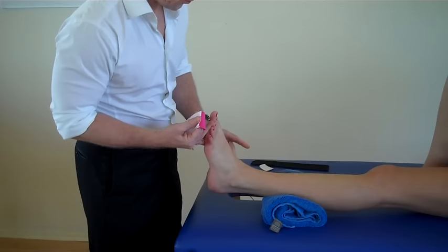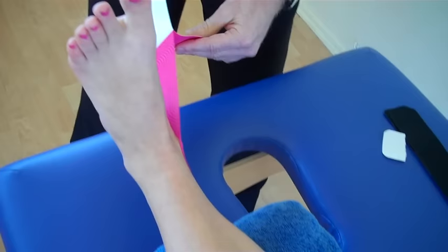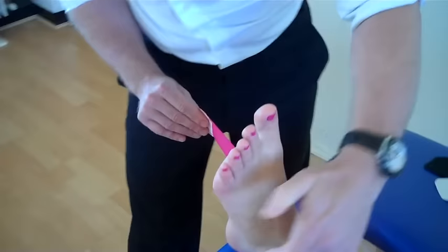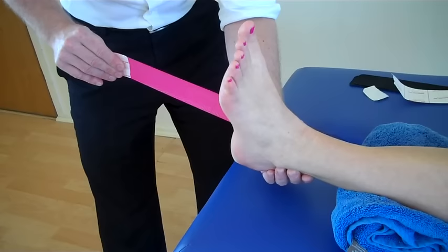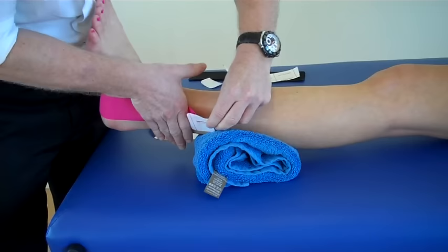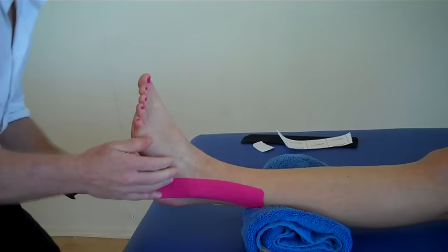Apply with no stretch just above the medial malleolus, then take most of the tape off. Because we're trying to stabilise the lateral malleolus and the ATFL ligament, we've got 100% stretch and just back off a little bit so we've got about 80% stretch. Under the foot, and then as it comes around the lateral malleolus, lock that down, and the last two or three inches just roll out. You can warm that up by using the back of the tape to make the adhesion stick a bit better. That's the first part.